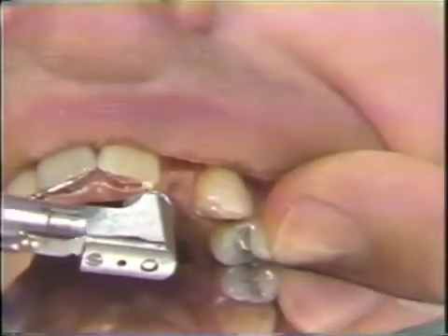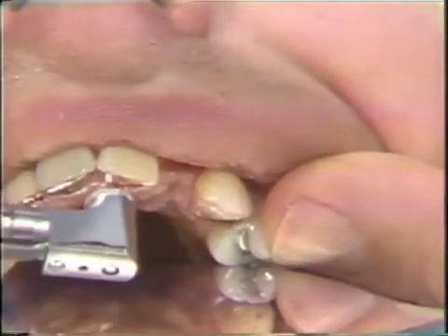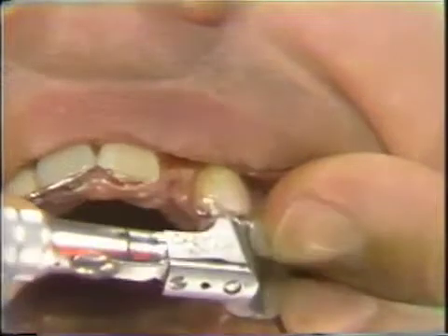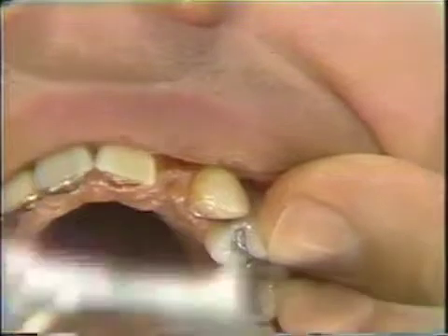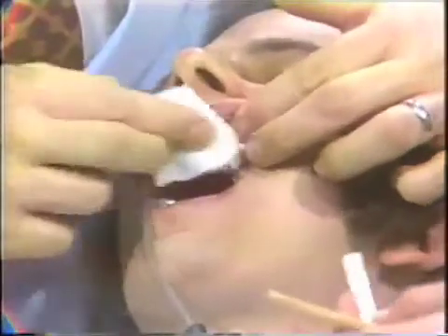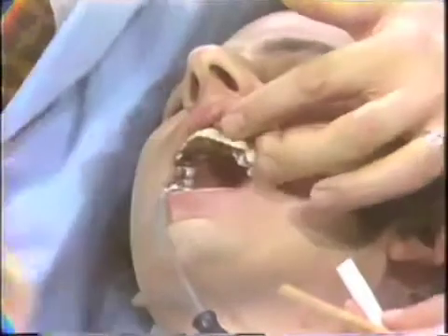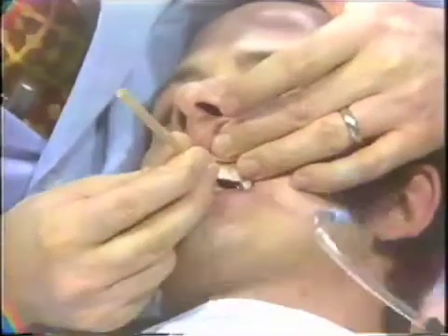Zinc phosphate cement is then spun down the pinhole, making sure the spiral is spinning in the proper direction. In this case we have two pinledge abutments. The loaded bridge is then seated firmly and the excess cement is wiped away with a gauze. Then an orange wood stick will be used to further seat the bridge, taking care not to fracture the pontic.